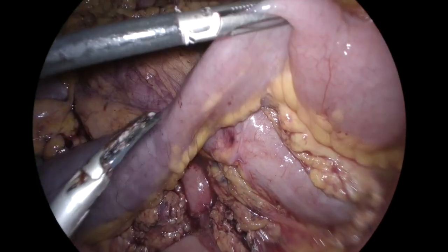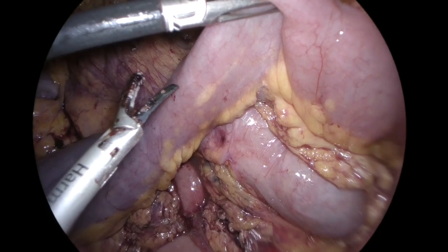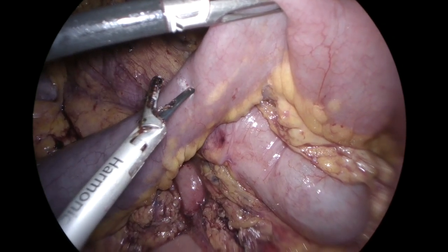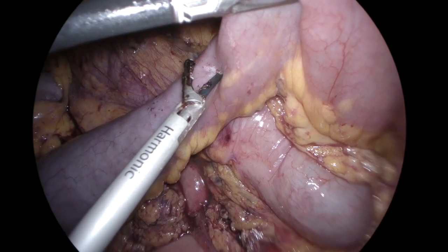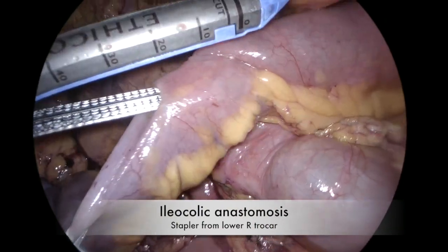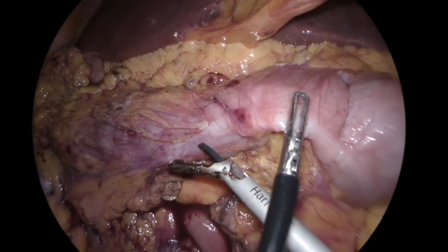Two enterotomies were performed at the level of the future anastomosis. The stapler was then inserted and fired as previously described. Surgeon position and trocar used did not change.